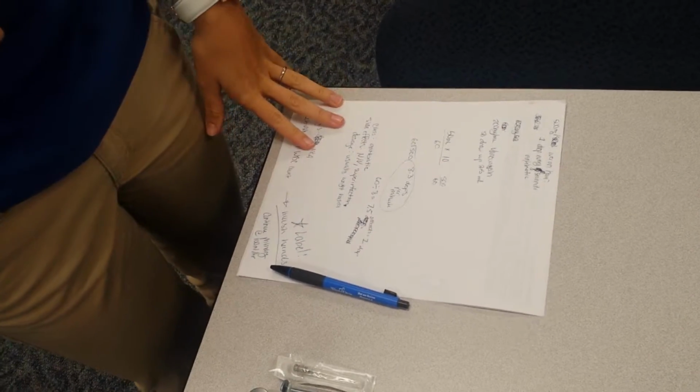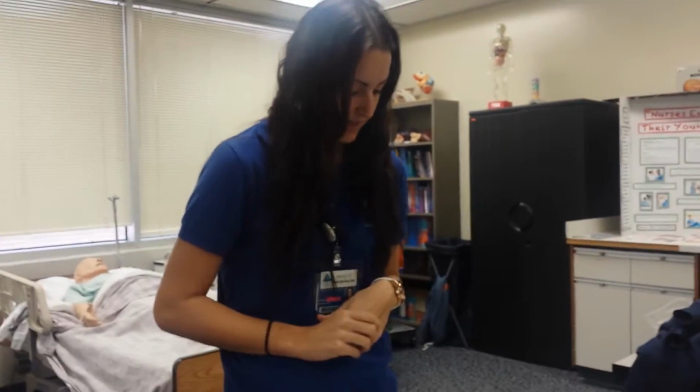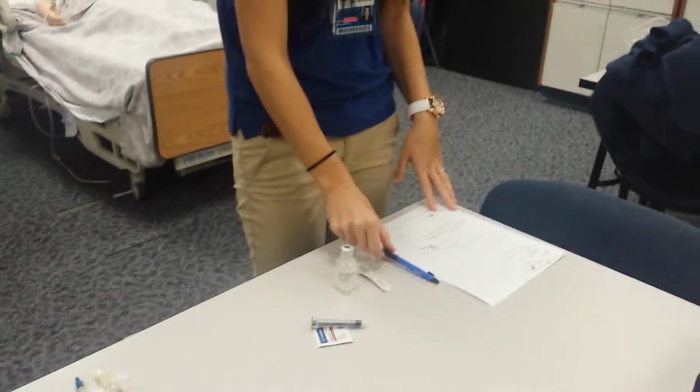So we did the calculations here, and we'll have 500 milligrams in a 50 milliliter bag, which comes out to about 8 drops a minute. So we want to see a drop in the drip chamber every 7 or 8 seconds. There is 200 milligrams per milliliter of vancomycin in my vial, so I need 2.5 milliliters drawn up.